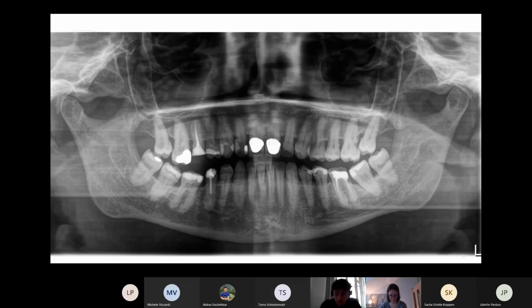All right, I'm just gonna start going over it tooth by tooth now. So you really have to mention everything if you go over an X-ray. Always mention something that seems obvious to you. Like here, for example, number 8 is non-erupted in the upper right jaw. So say that, and then continue tooth by tooth. So number 8 non-erupted, 7 is nothing. Number 6, we have an MO class 2 filling.